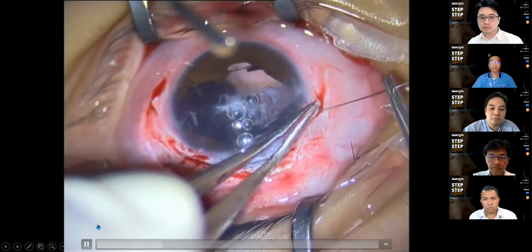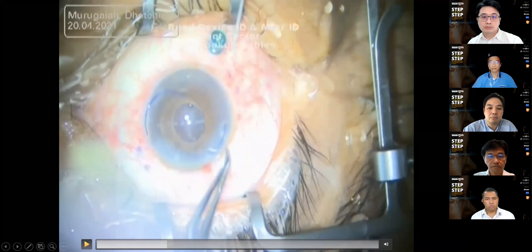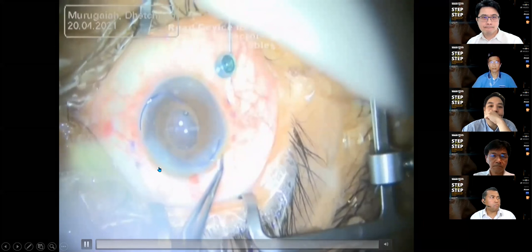Once you see the needle, you can change the direction of the needle. Here, I would like to share with you what happens when you don't introduce the needle perpendicular to the ocular surface. This is another case, sorry for the poor video. Please ignore the name. Please focus on this area.